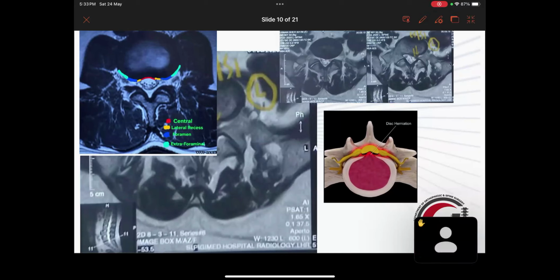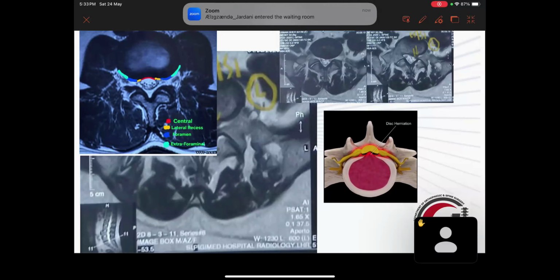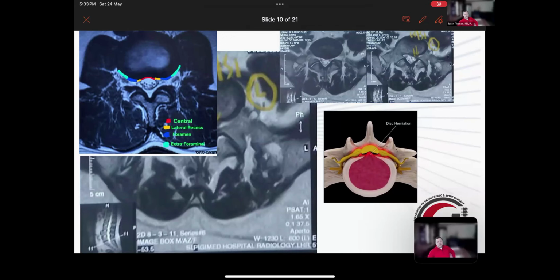So it's basically the surgeon's choice, whatever he is comfortable with, drain or not. Am I right, sir? Correct, at least for me. And the drain comes out within an hour or so after surgery, before the patient leaves PACU to go home. Thank you so much. I do uniportal surgeries, and I've never placed a drain, and I've never had a problem by not inserting the drain. So that's my experience.